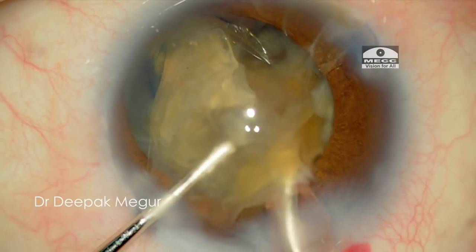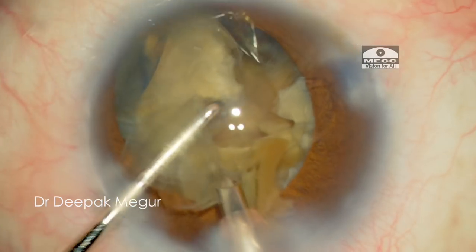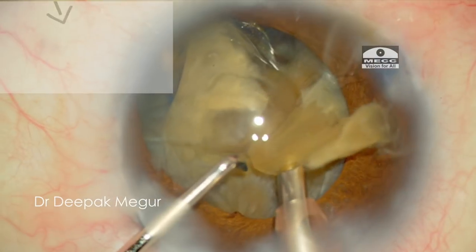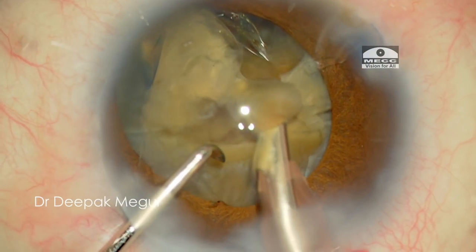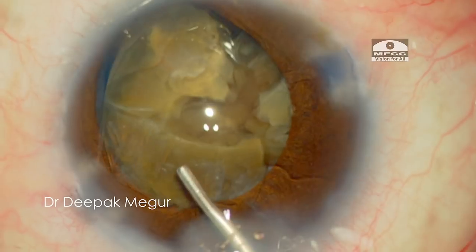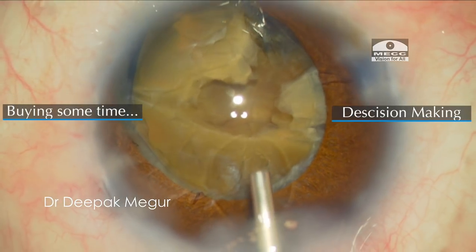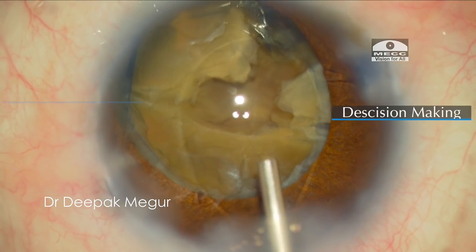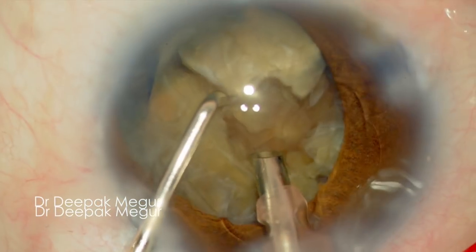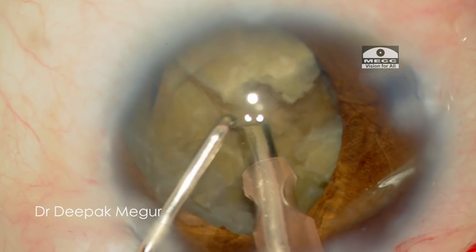The fragment which was engaged in the tip is pulled anteriorly into the anterior chamber and I am emulsifying the nucleus. At this moment, I am thinking how to go ahead — should I continue FACO, and I am also seriously considering whether to convert to SICS. Whenever I am having difficulty making a decision, my strategy has been to just keep injecting OVD inside the eye — buying some time to help with decision making. Since some nucleus was already chopped with multiple fragments present, I decided to continue with FACO as it was manageable and would be less dramatic.